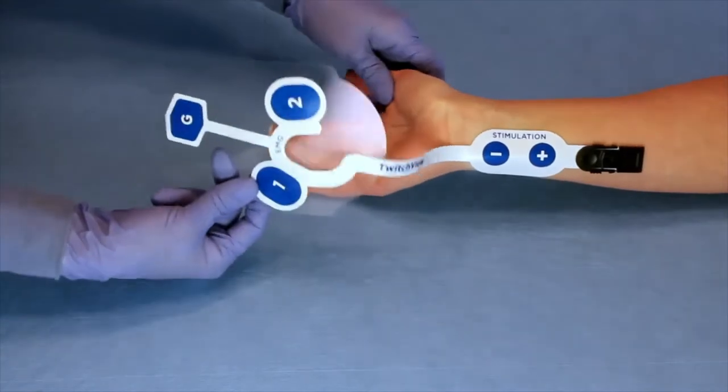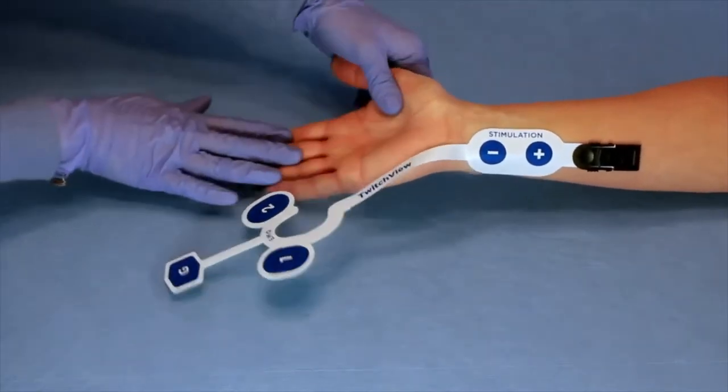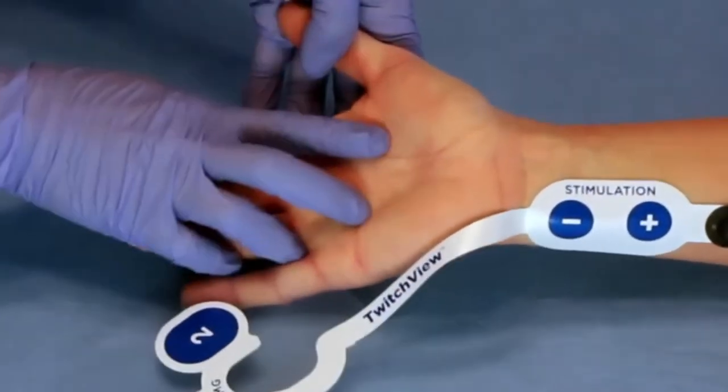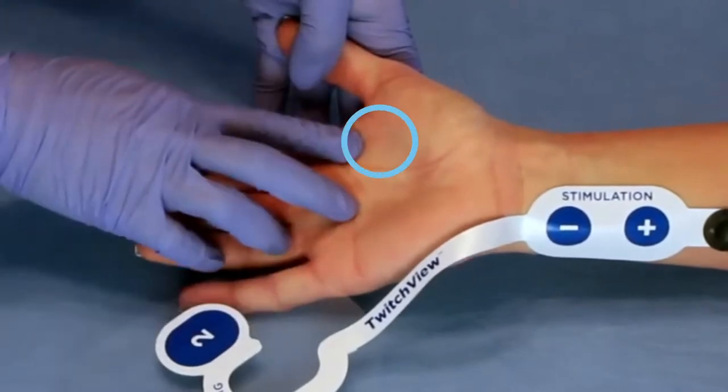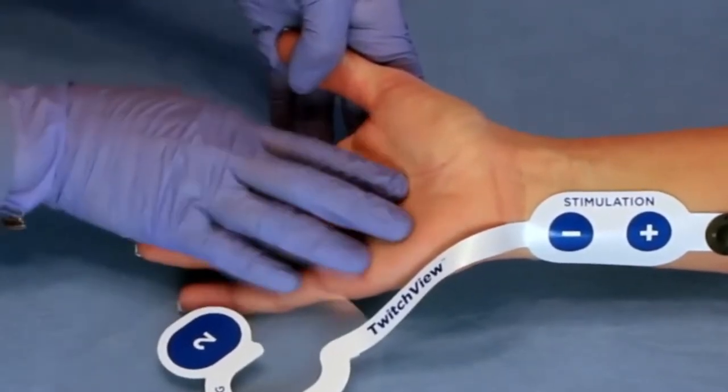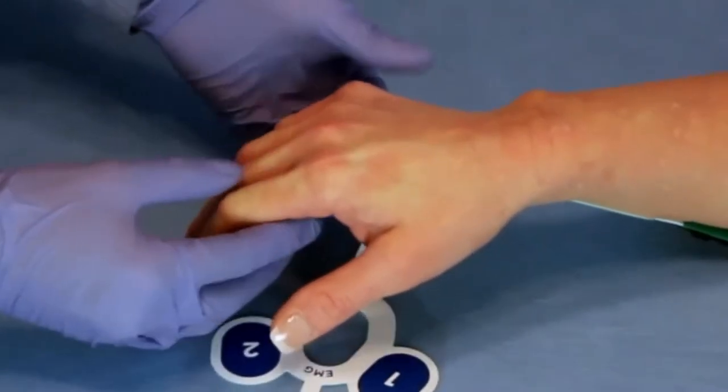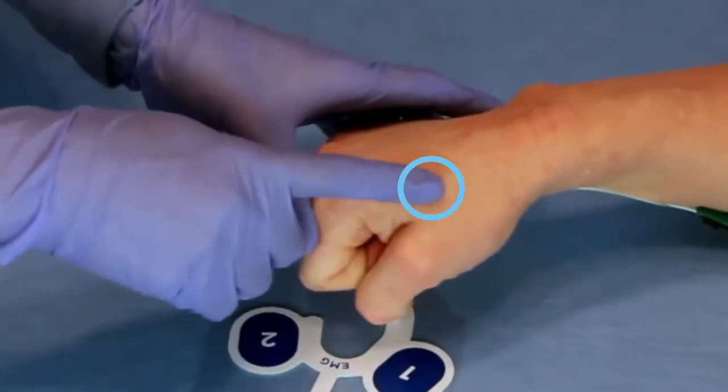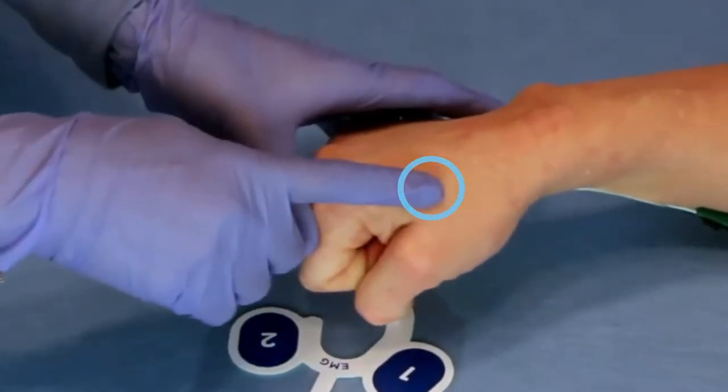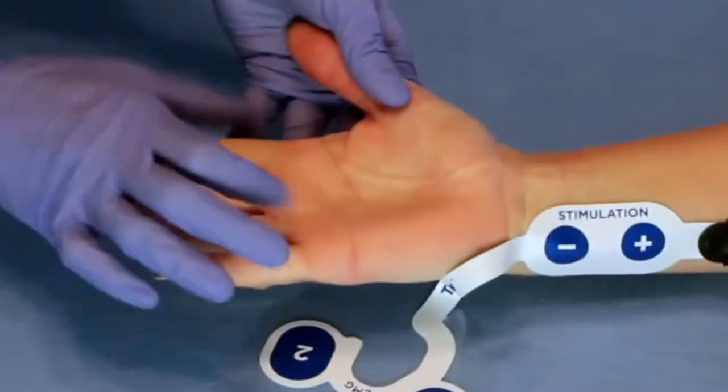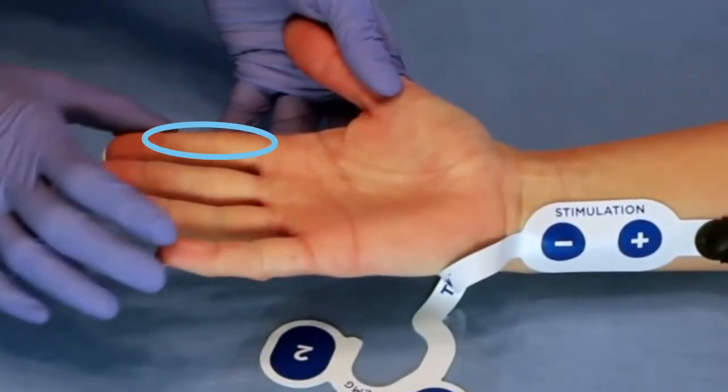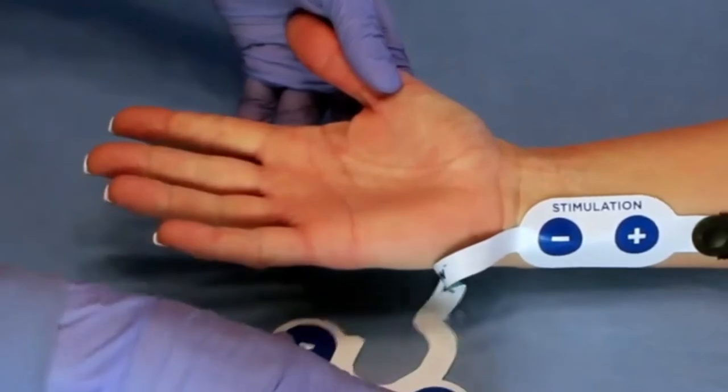The EMG or electromyography recording electrodes are placed over the adductor pollicis just distal to the thenar eminence and on the first dorsal interosseous muscle on the back of the hand. The ground electrode is placed on the index finger.